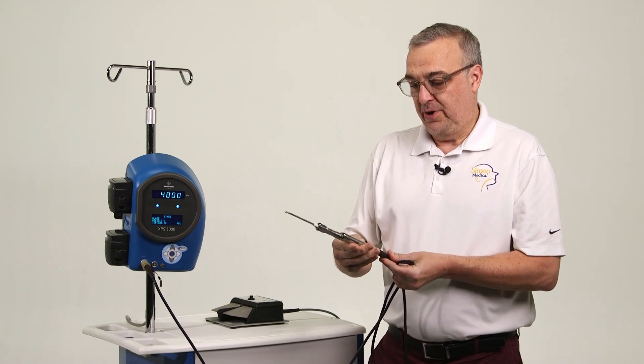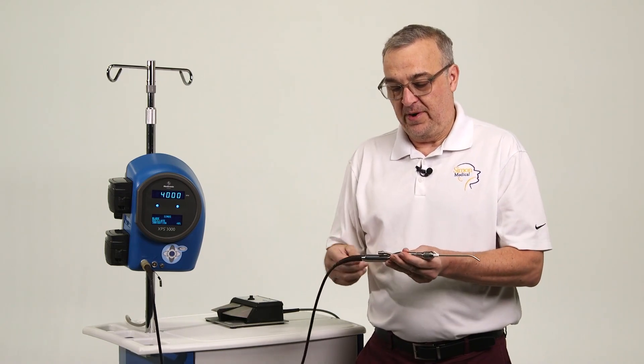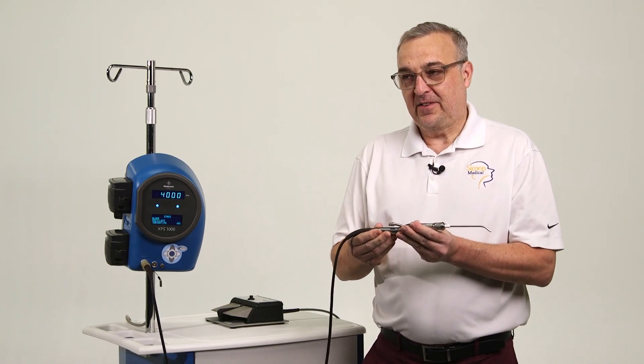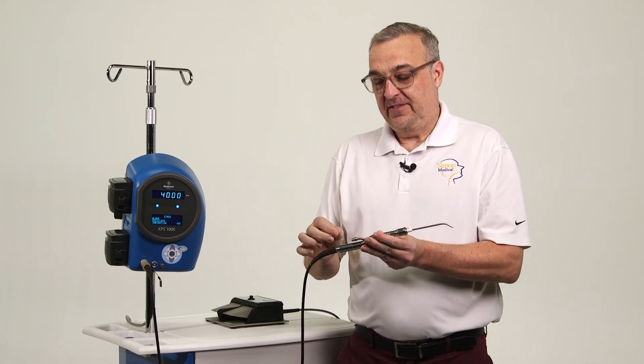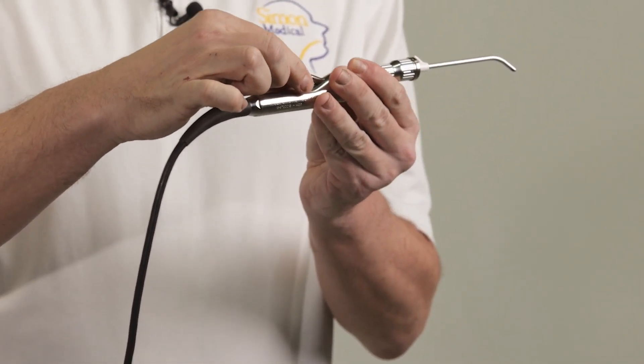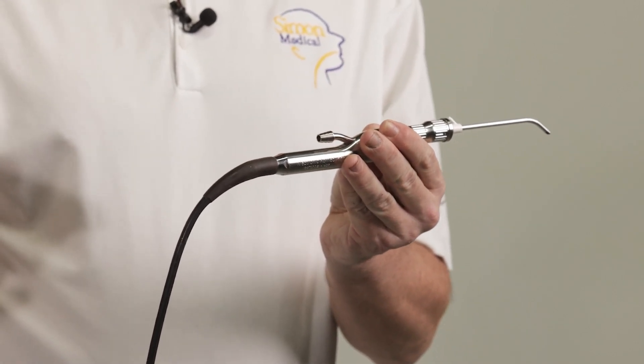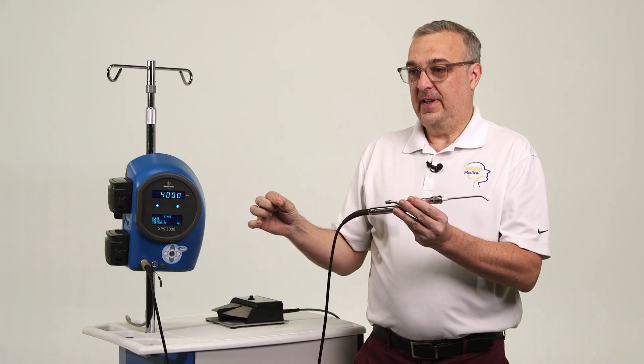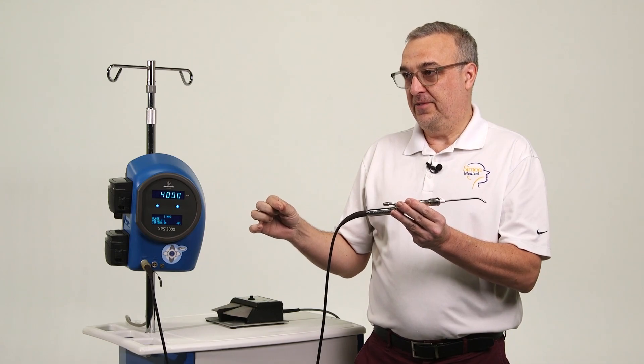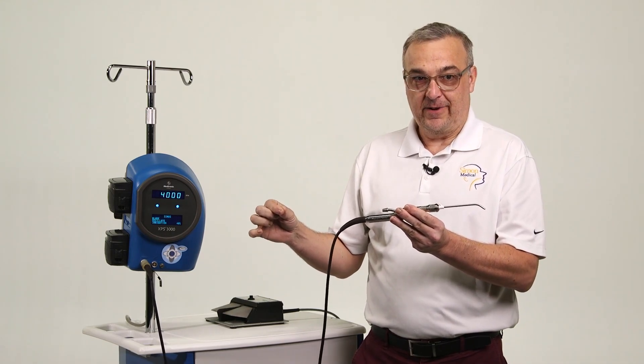With the microdebreeder, one of the very important aspects of not having a clog is having good suction. So your suction is going to go in here, make sure your suction's on as full power as you can tolerate.